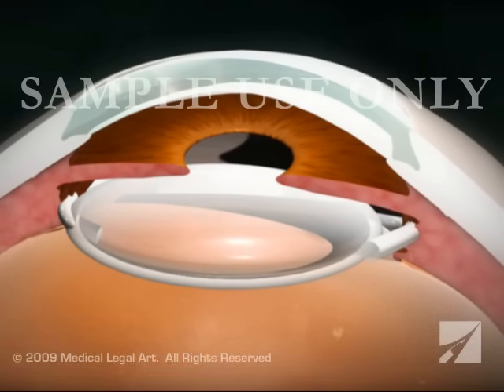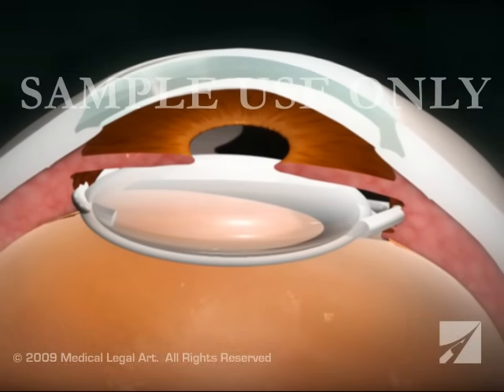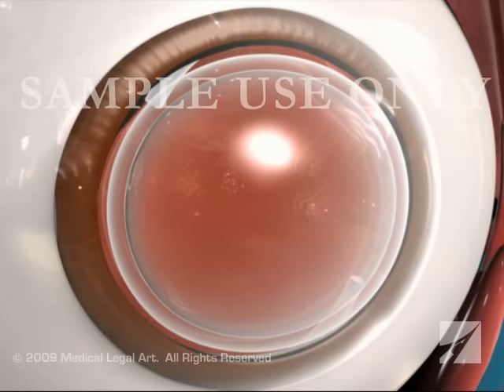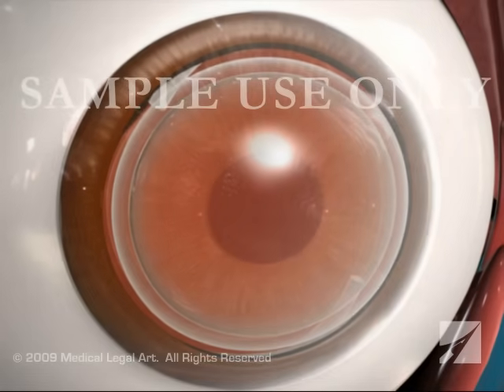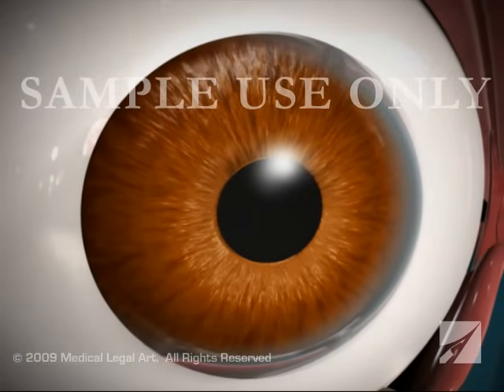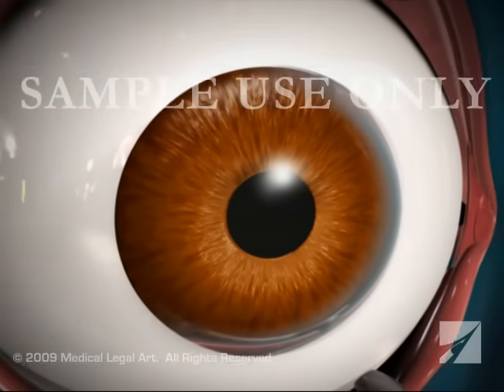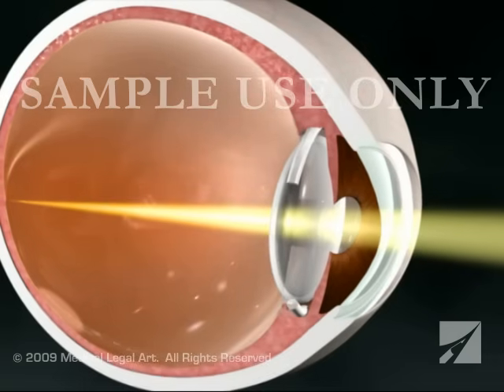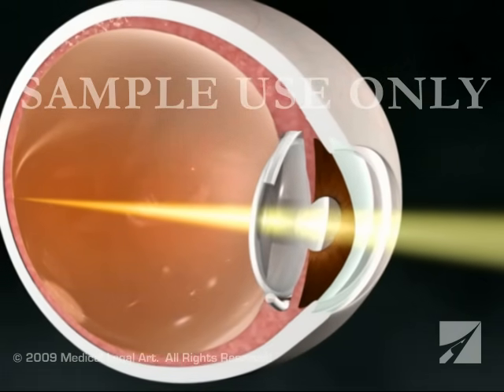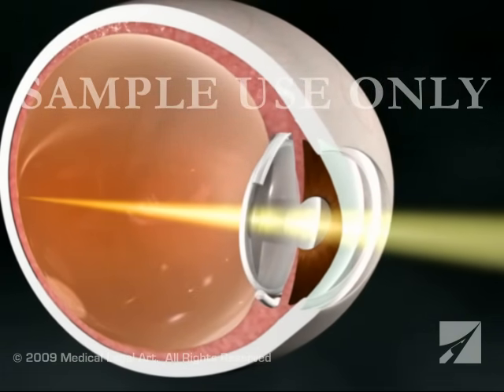Intraocular lenses have no moving parts and last for the remainder of a person's life. Because the incisions are so small, stitches are generally not necessary. Vision often improves notably immediately after surgery.